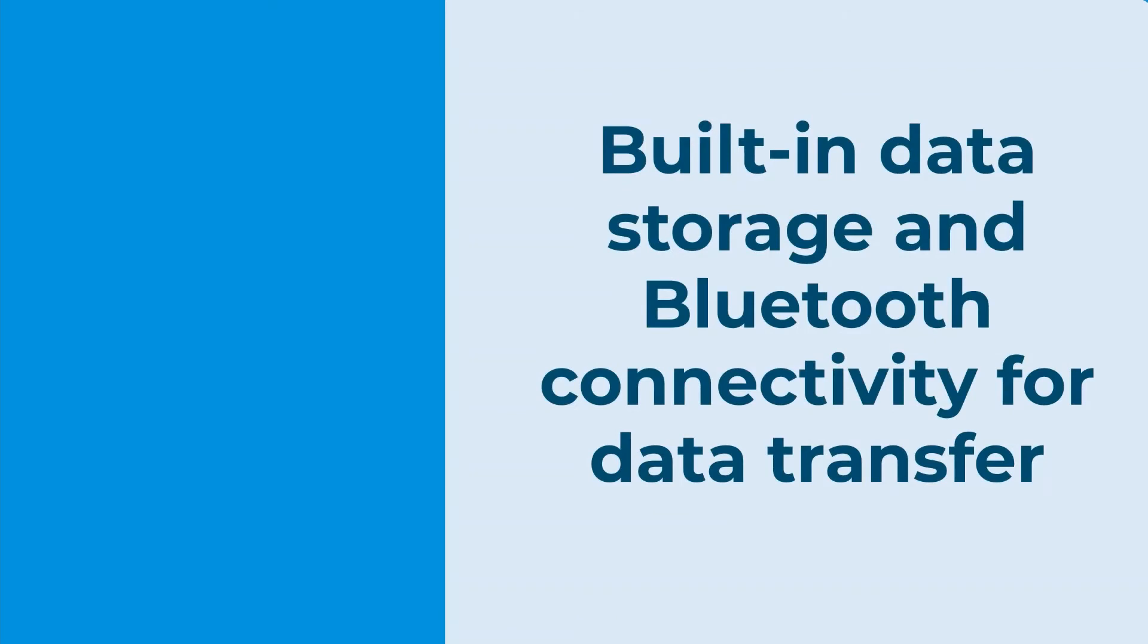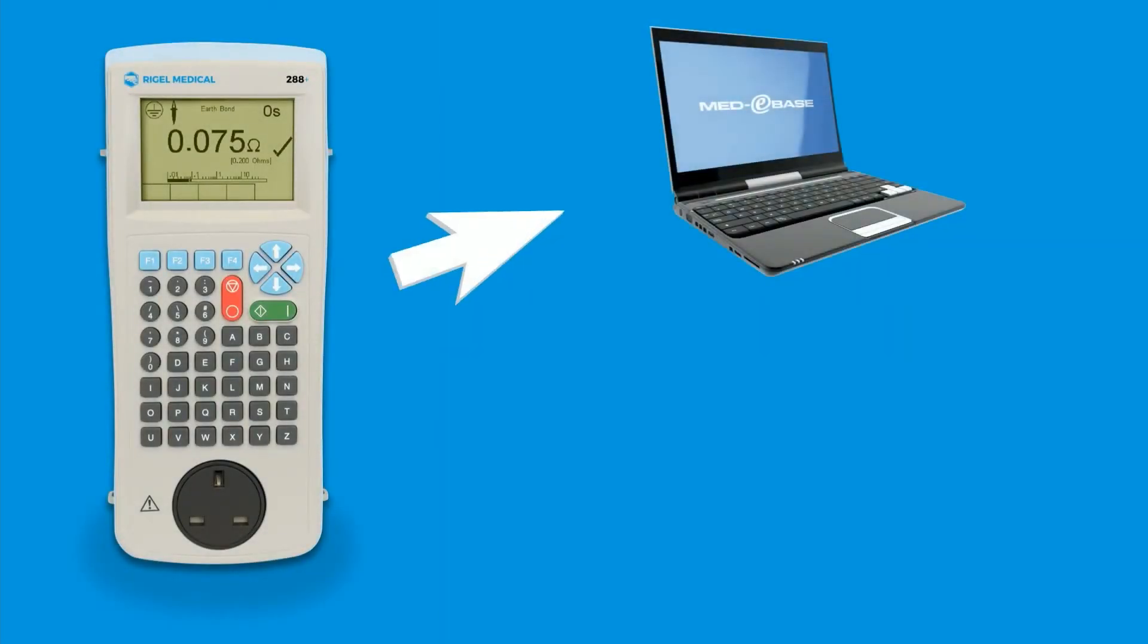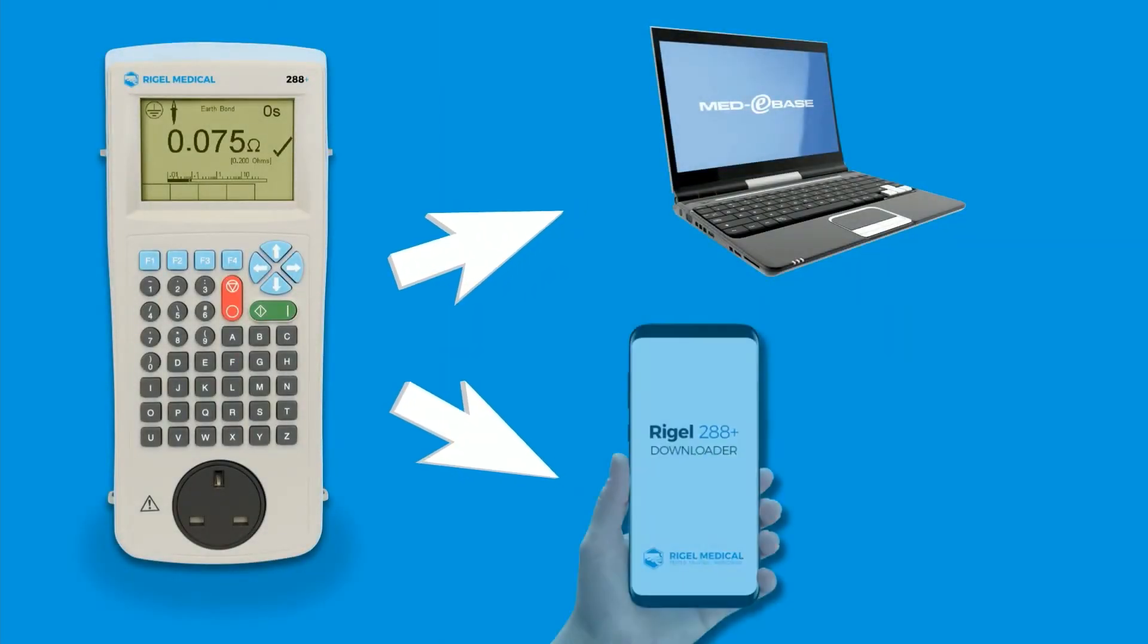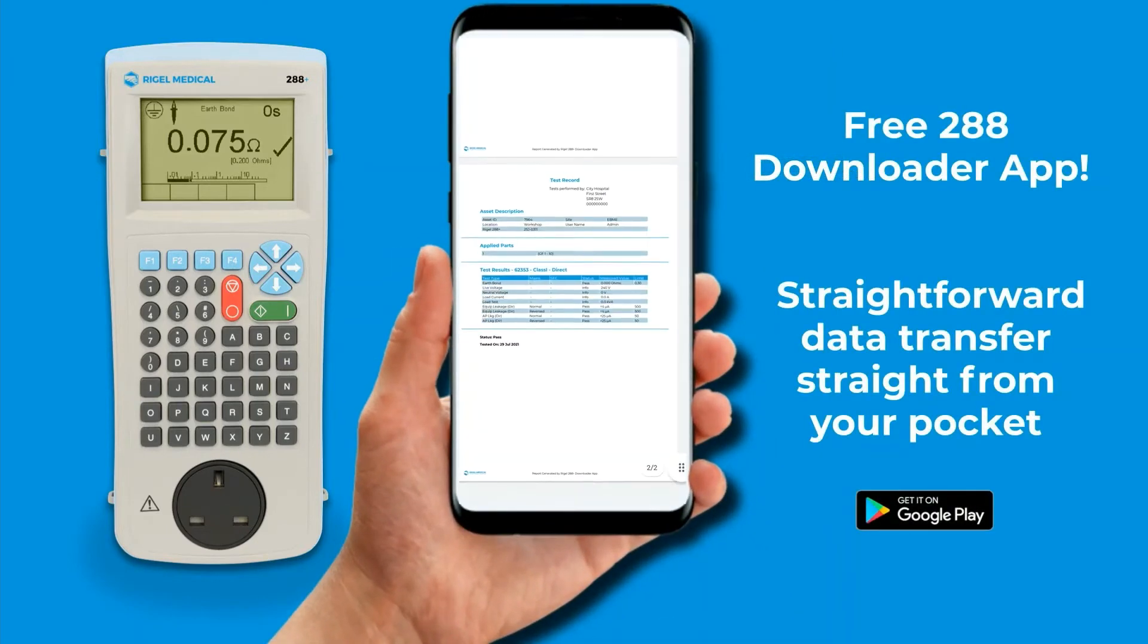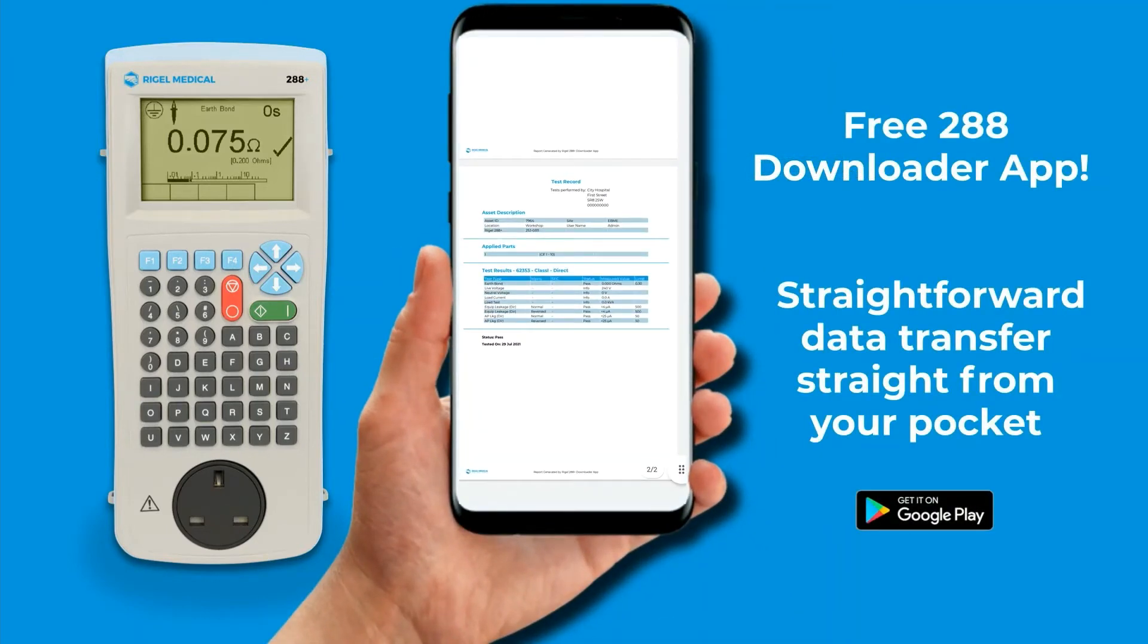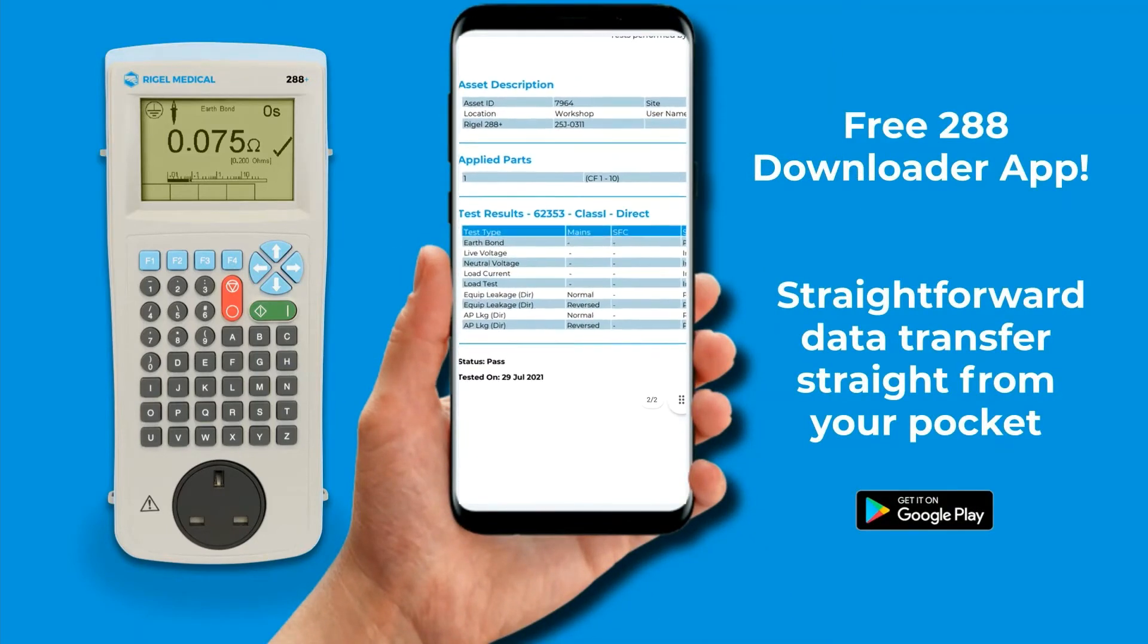With built-in data storage and Bluetooth transfer for downloading results to your PC or with our free downloader app where PDFs are produced and can be attached to your work orders.